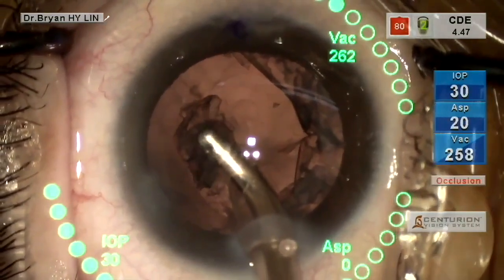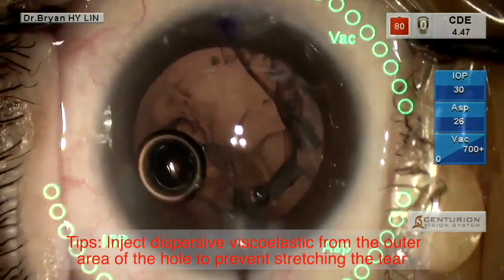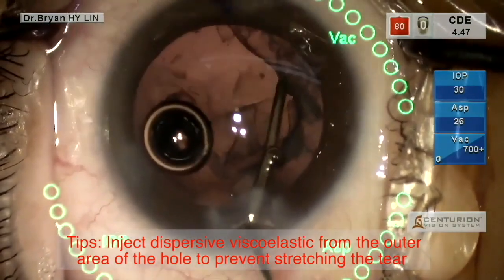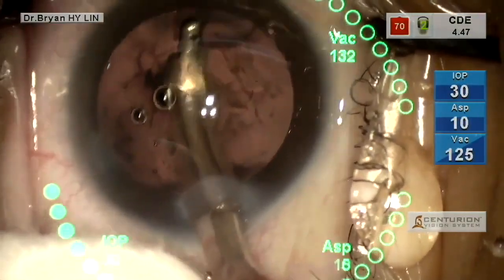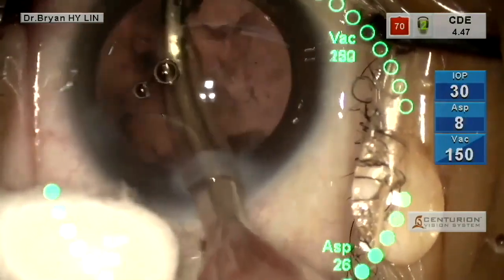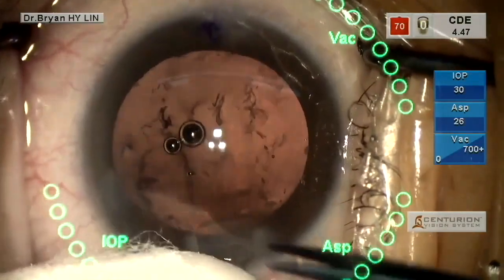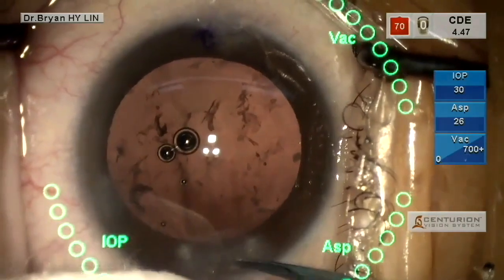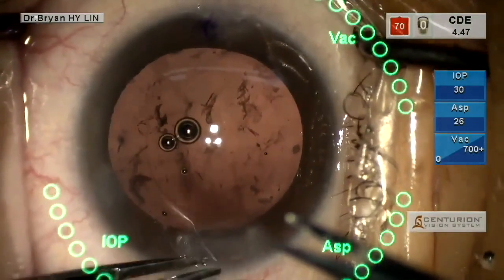Vitreous strands are often hard to see. If you accidentally grab vitreous, the vacuum will rise immediately, and you have to reflux aspiration right away. If the rent is kept small and prolapsed vitreous is little, try to fill the anterior chamber and bag with dispersive viscoelastic. Otherwise, an anterior vitrectomy should be launched. Use a cotton swab to test if there are vitreous strands incarcerated at the incision site. Since the posterior capsule hole is stable and small for now, IOL implantation can be performed.